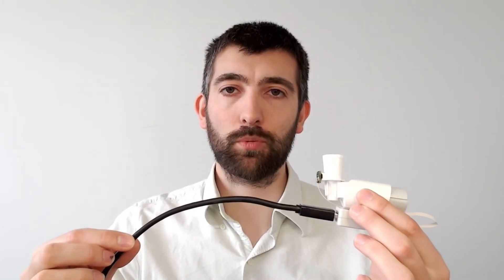Alright, so I have the FLS110 connected to my laptop by this black USB cable here. Now I'm going to take some breaths on the inhaler and we'll be able to measure the flow using the FLS110.